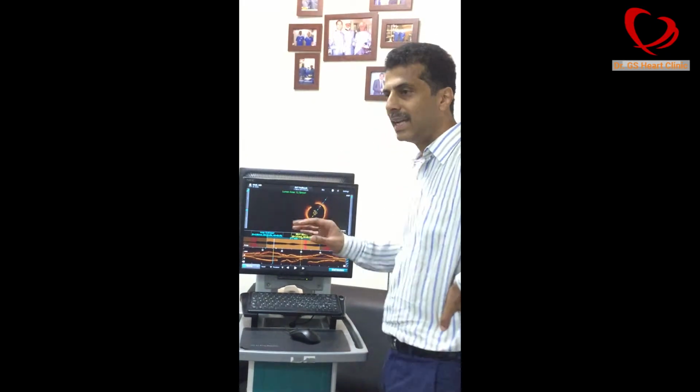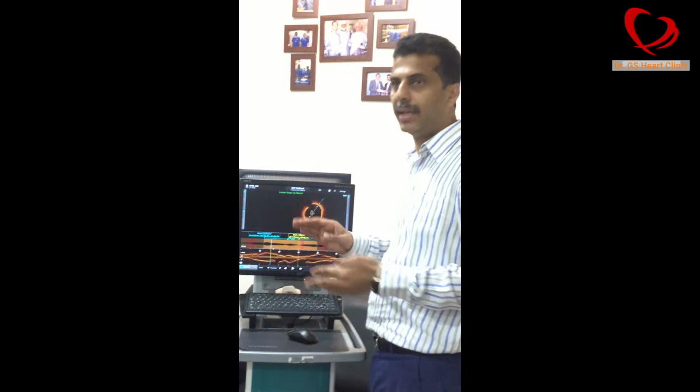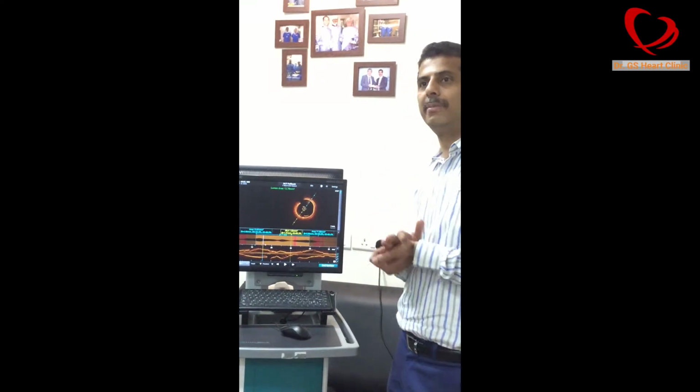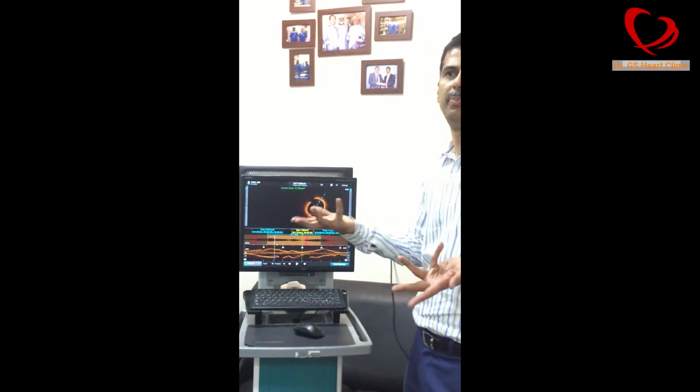So this is like an angiogram again. It's a photo. It's not telling the flow. It's only telling that there is a narrowing there. The angiogram didn't pick it up because the angiogram was a two-dimensional picture, and in an area where it divides, the angulation was not good enough to pick it up.